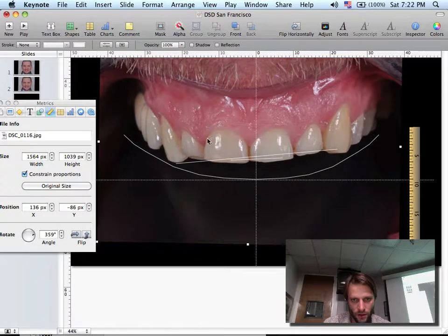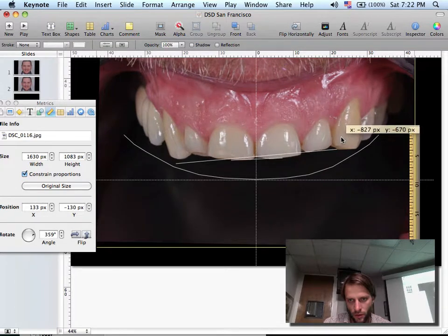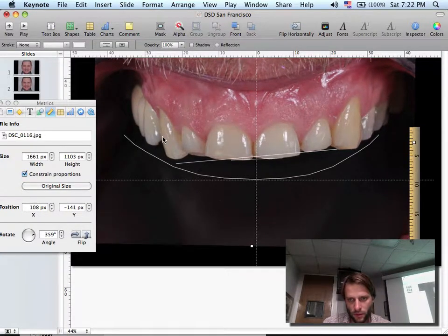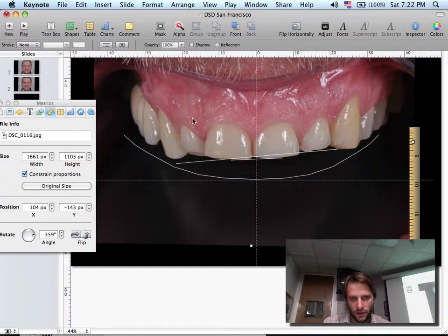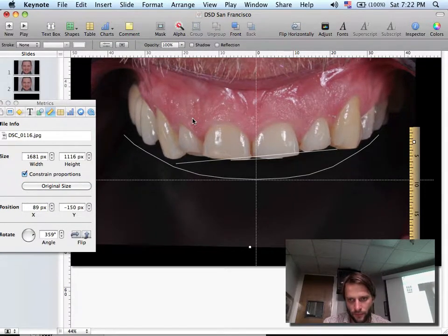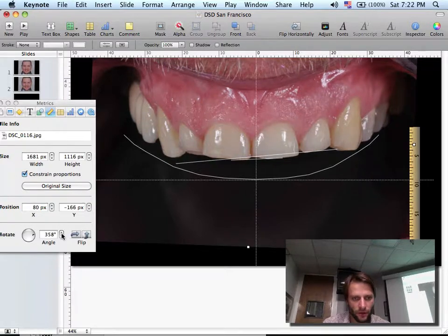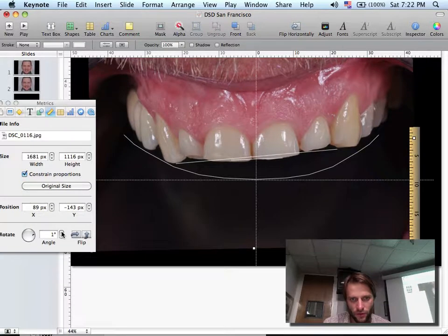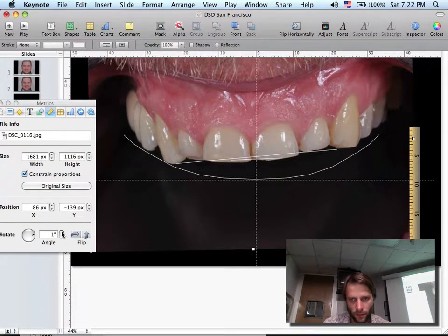So here one. Oops, this one is already too small. Now it's touching this one, but it's away here, so it's a little bigger. Touching here, not touching there. Again, touching here. The size is pretty much okay, so now it's just a matter of twisting, moving down, twisting, moving down. So this is pretty much it.